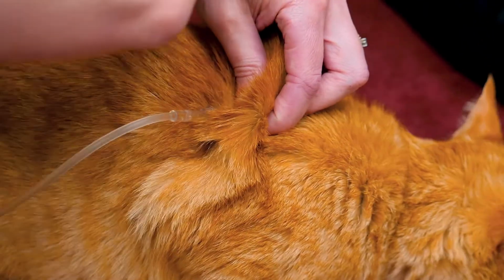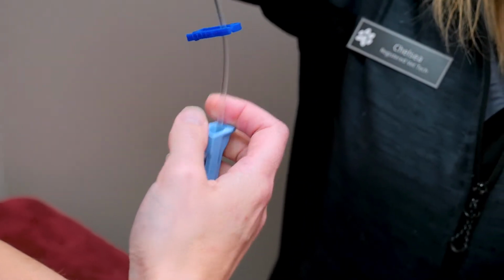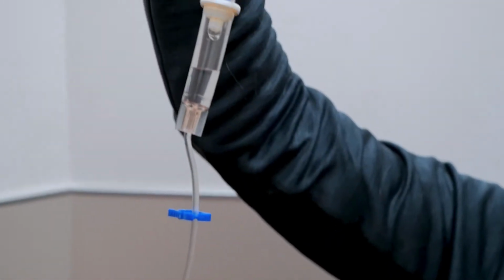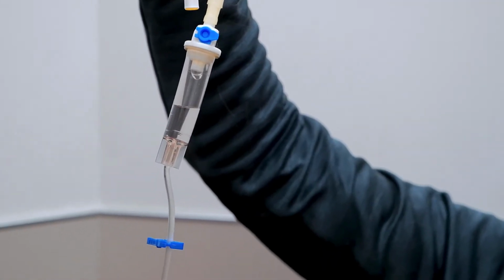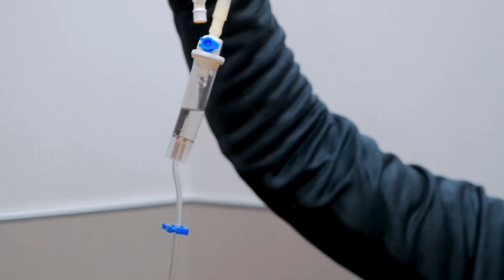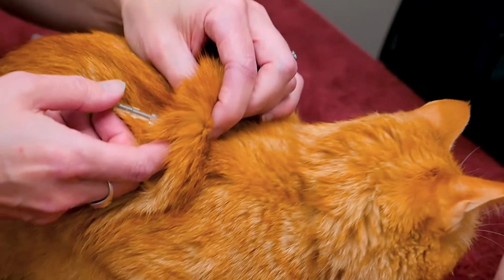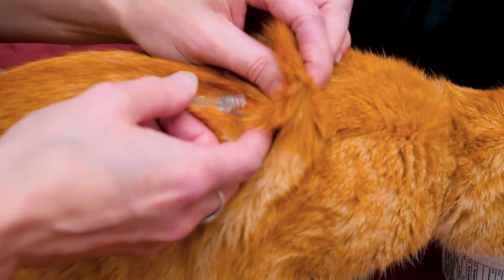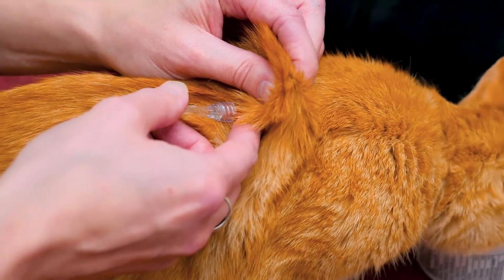Once the needle is in, you're going to open up this little port and let the fluid start to flow. And you can see that starting to drip there. Good boy, Hobbs. If you put that food closer, he'll just eat. So Hobbs doesn't really seem too concerned about this.